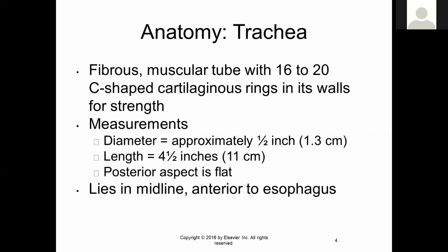And in fact, when we need to see the esophagus for an exam, we have to use some type of contrast media such as barium or iodine that will absorb a lot of x-rays and show it on our picture. Otherwise, you typically do not see the esophagus if nothing's in it.